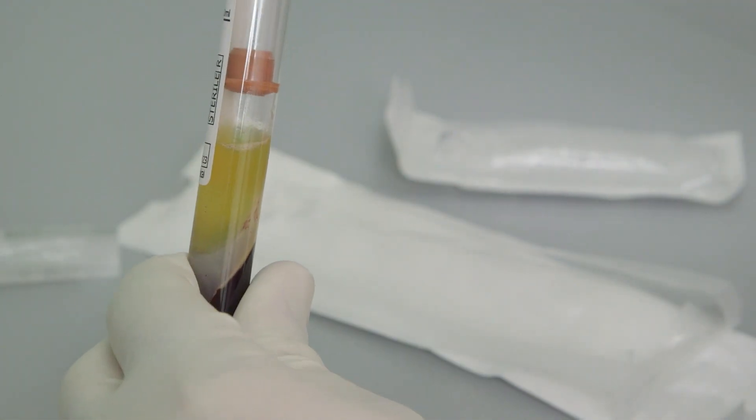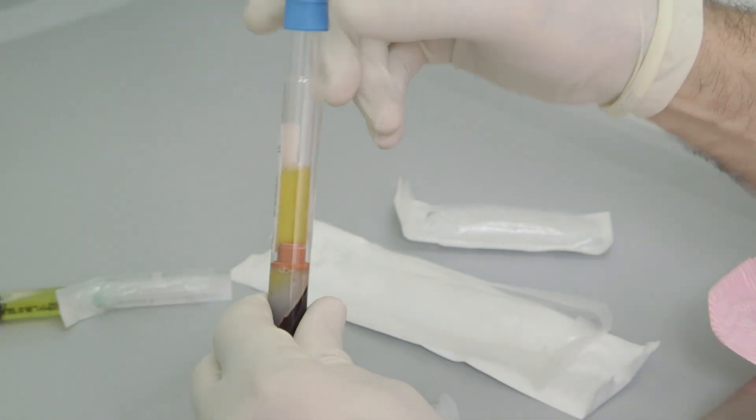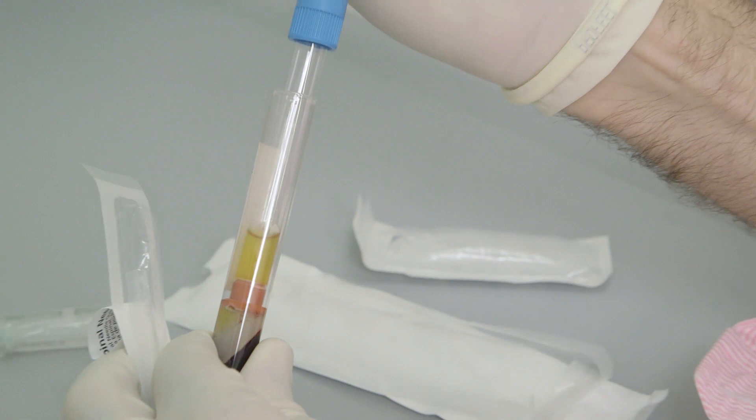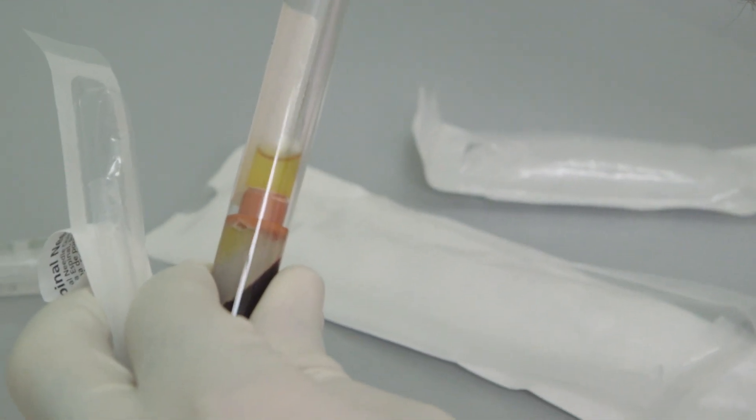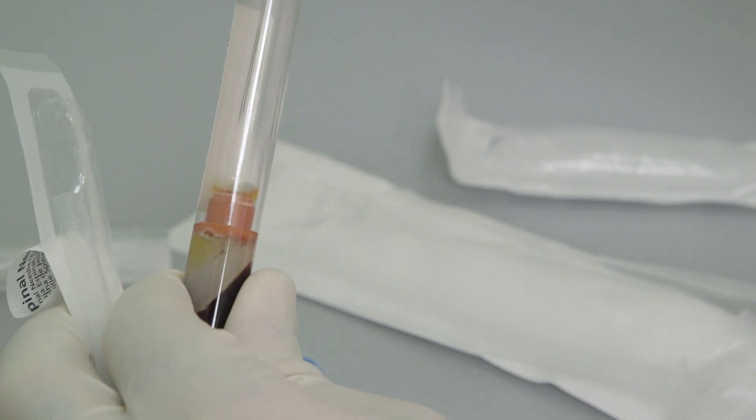All of this procedure is performed in a negative pressure fume chamber to ensure safety. Once the platelets have been re-added to the plasma, a filter is applied and the solution is then withdrawn.